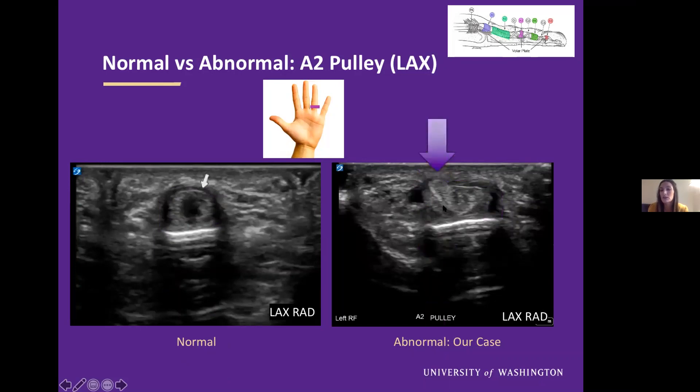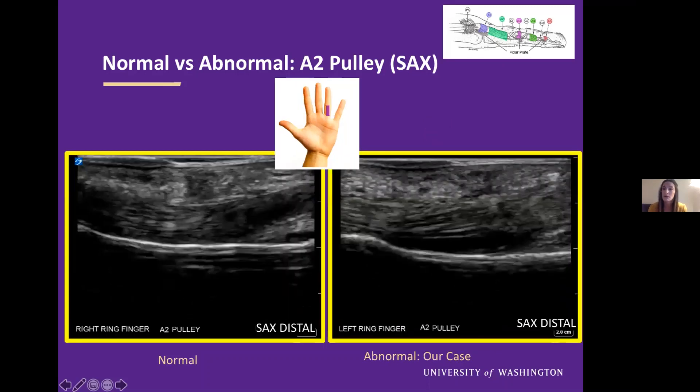Additionally, we see that there's some superficial migration of part of the flexor tendons — at this level it is the FDS tendon that we think has superficially migrated. Now that we have seen this in one view, we want to confirm it in our other view. We'll look again at normal versus abnormal of our A2 pulley now in short axis, still at our proximal phalanx.